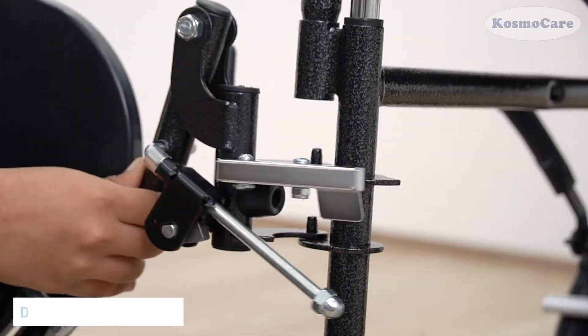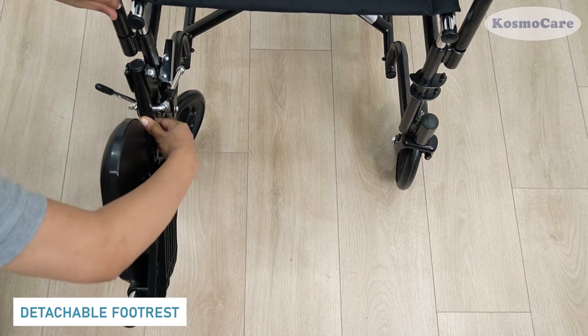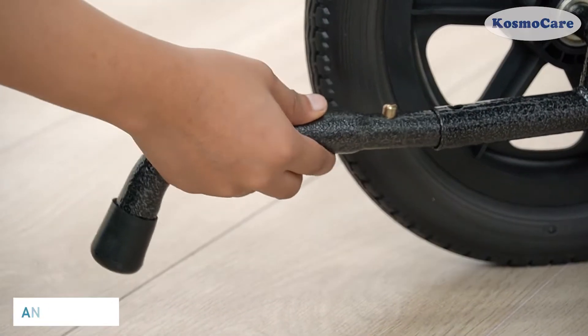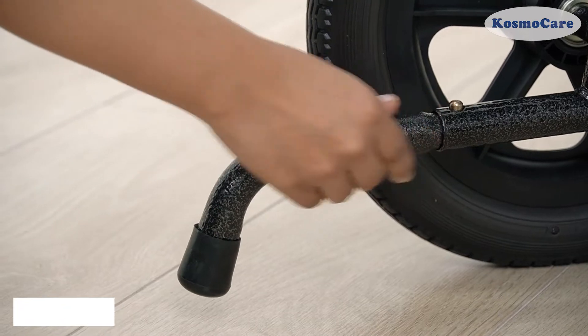Swing-away footrests make for comfortable transfers on and off the wheelchair. The anti-tippers provide additional safety by preventing the wheelchair from tipping backwards.